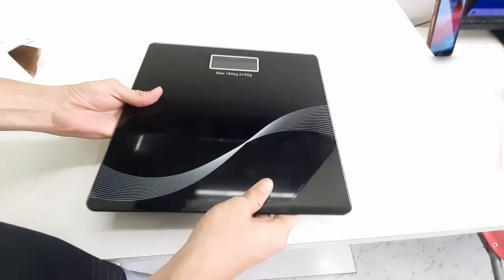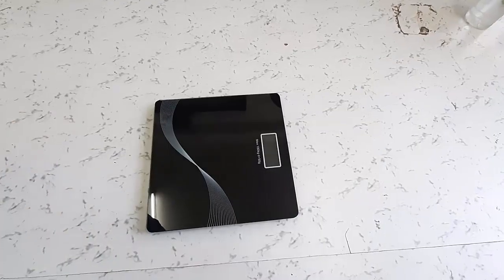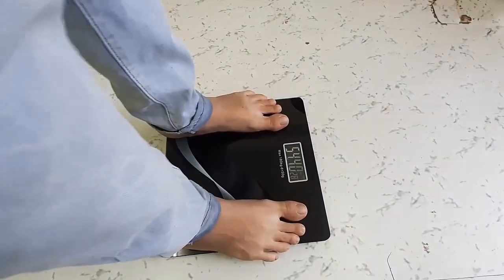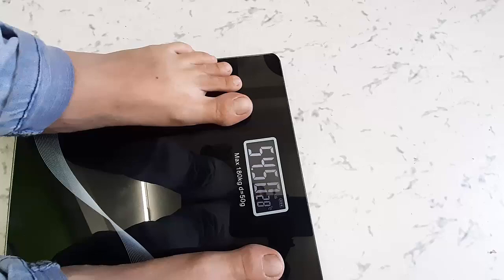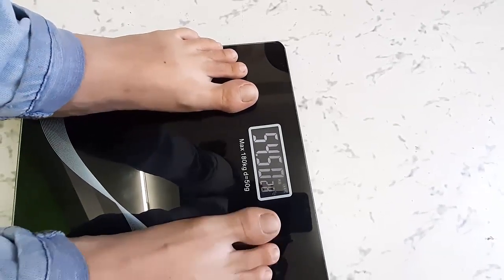This is the battery compartment — it runs on two batteries. Now let's see how it performs. The current weight reading is 54.5 kg and the temperature is 28 degrees Celsius. I will check again after 30 minutes.